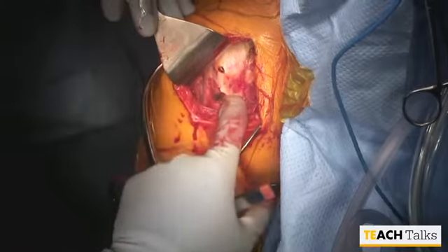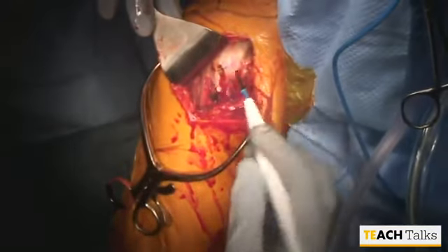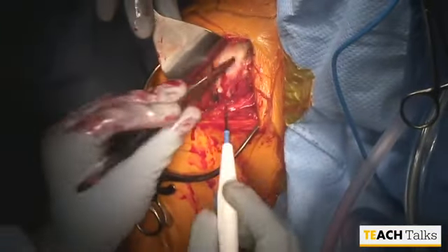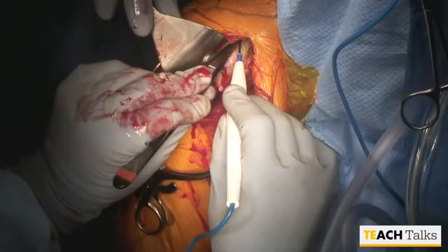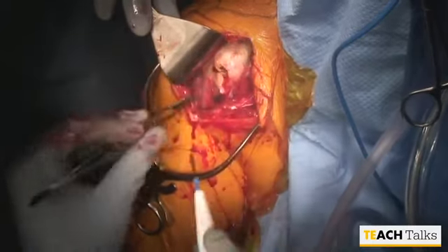Additional development of the subcutaneous tissues and mobilization of the cephalic vein medially for improved exposure can be performed. A limited release of the coracoacromial ligament can also improve exposure. We can then move on to the next portions of the procedure.